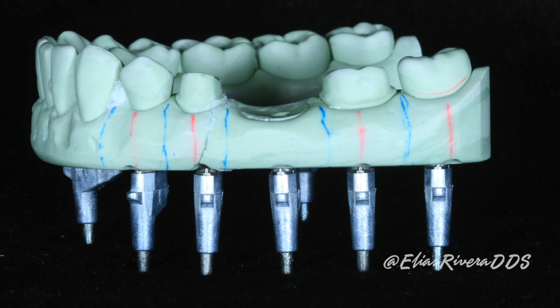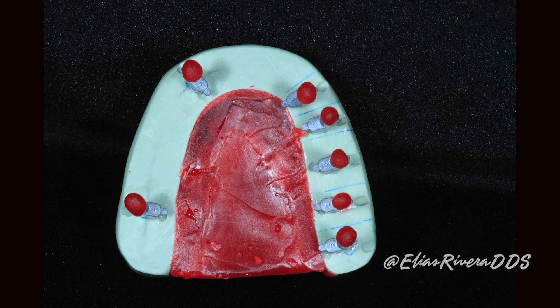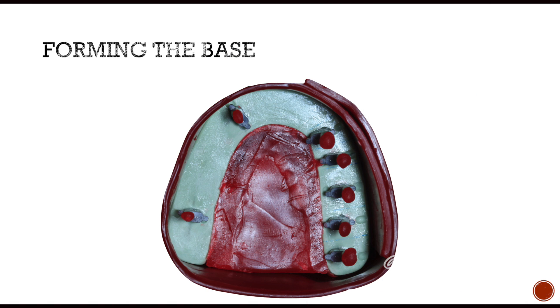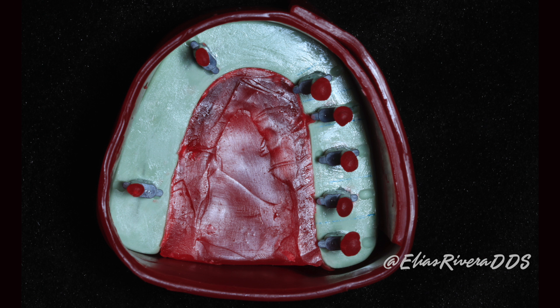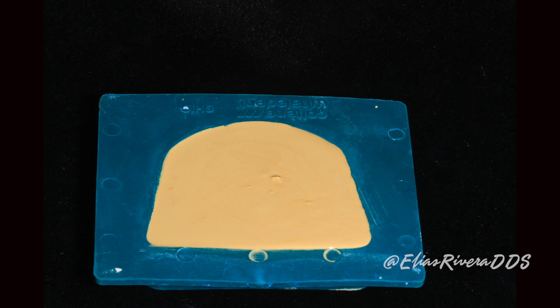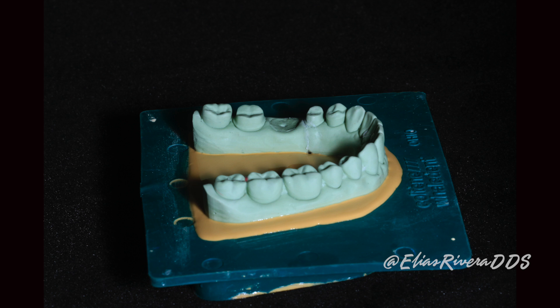Now is the time to make our second base. For this, we are going to place red wax at the end of those dowel pins, then we are going to lubricate our first base and proceed to box using utility wax. Alternatively, we can use base formers — all we need to do is pour some stone and place our first base down, then wait for the stone to set.